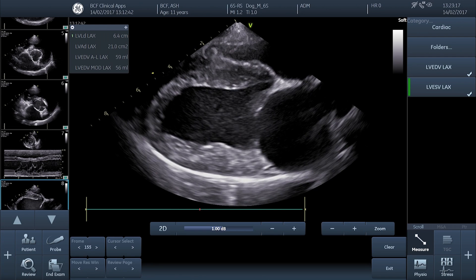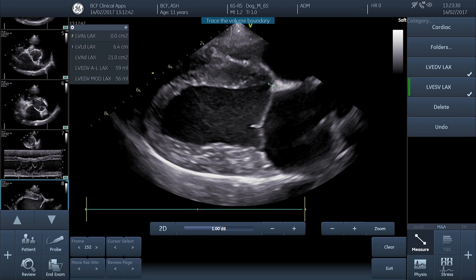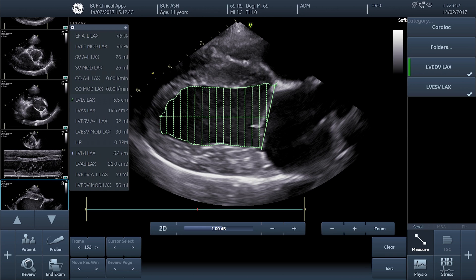The next step is to repeat the exact same process, but this time for end systole — i.e. when the left ventricle is at its lowest volume. We scroll forward until we find the last frame in which the mitral valve leaflets are closed, such that skipping forward one more frame would show those leaflets just starting to open. We then trace the outline of that left ventricular lumen in exactly the same way, getting the same lines and the same calculation for left ventricular volume at end systole.